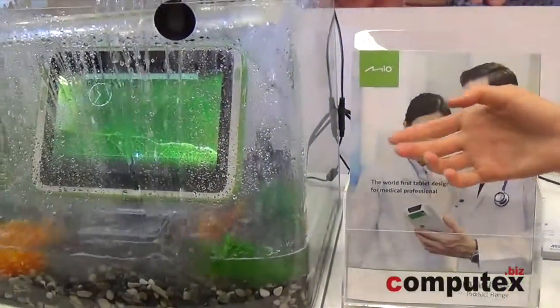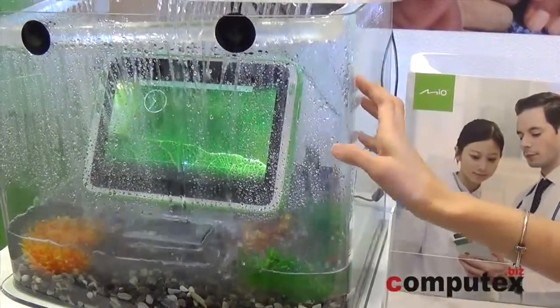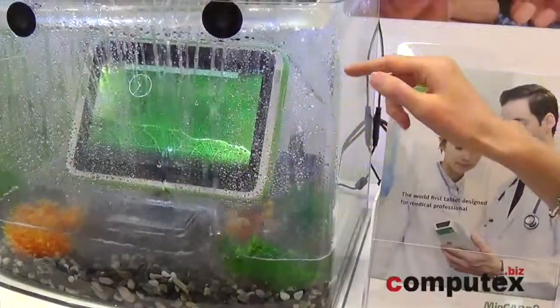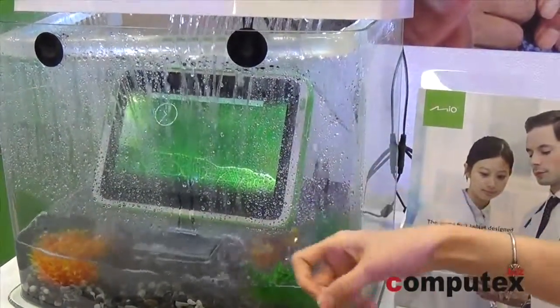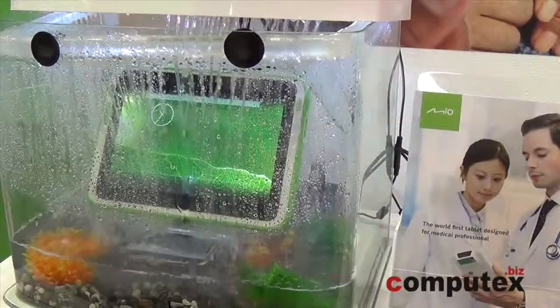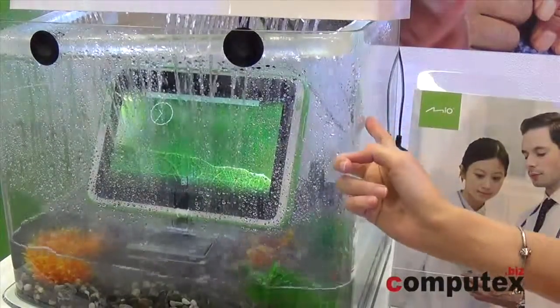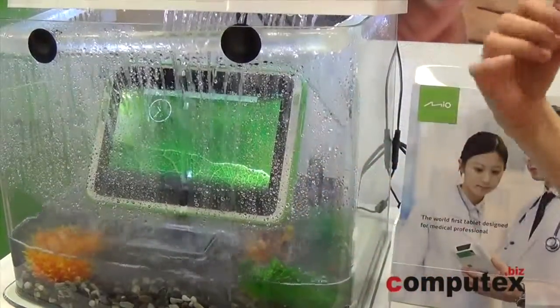This is a stronger spec — IP67 rated, 10.1-inch display with a digitizer, so you can use the pen to sign. We also designed this for a 1.2-meter drop rating, so it's stronger than the smaller one.